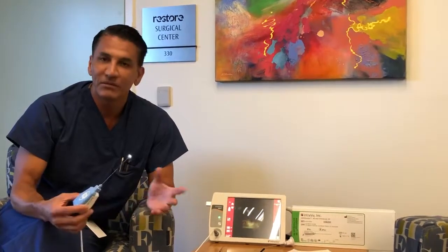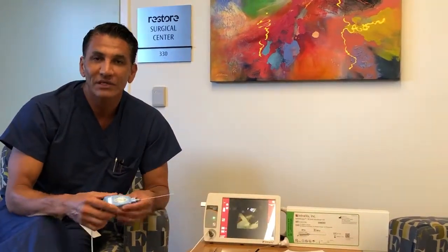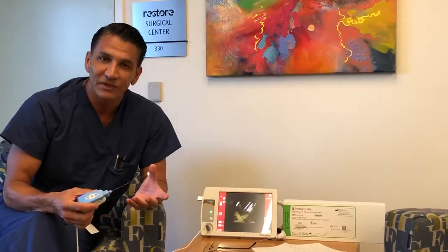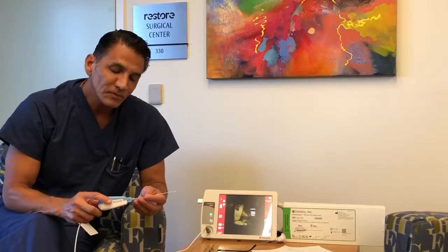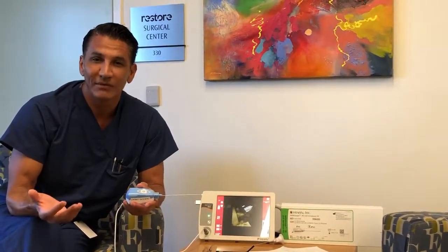It's a 15-minute procedure. I'll look, and if it looks like it's an ugly meniscus tear that has flaps already eroding the cartilage, I'll be able to tell you with much more accuracy and confidence, and then everybody will be happy, and in the end, you will not have done any harm. So once again, that's the patient that has a meniscus tear. They're not certain whether they want to have surgery or not, but they also don't want to damage their joint.